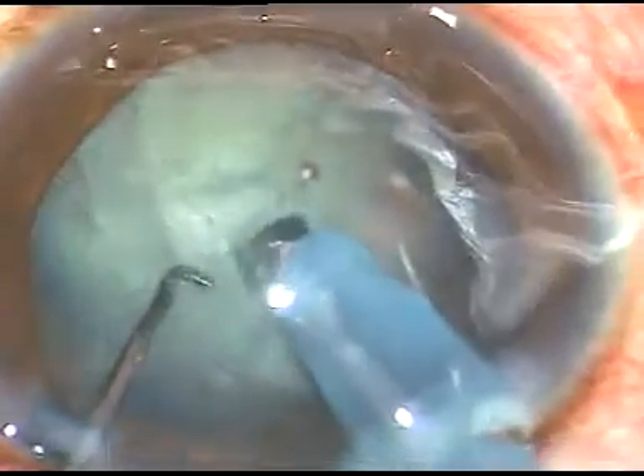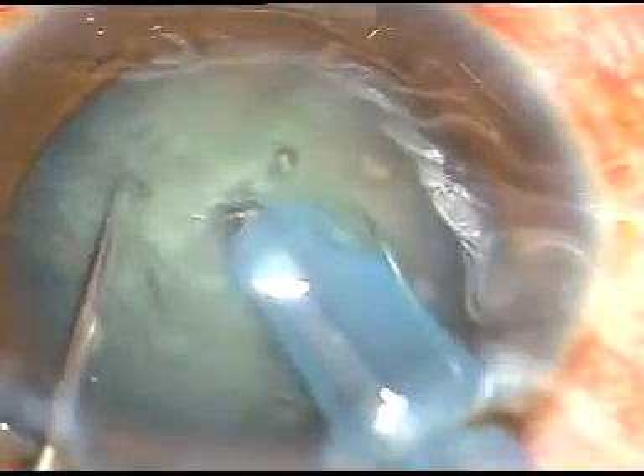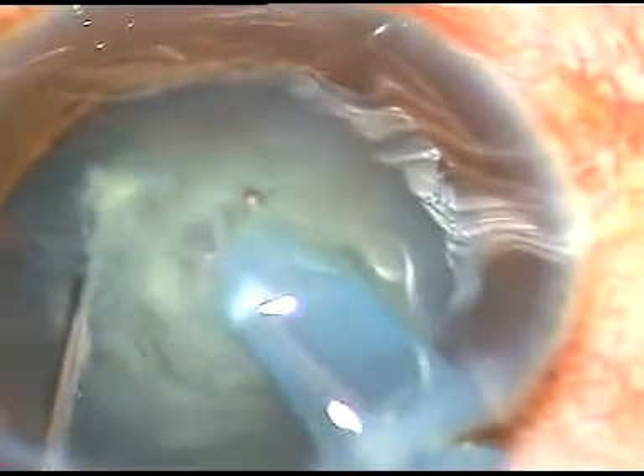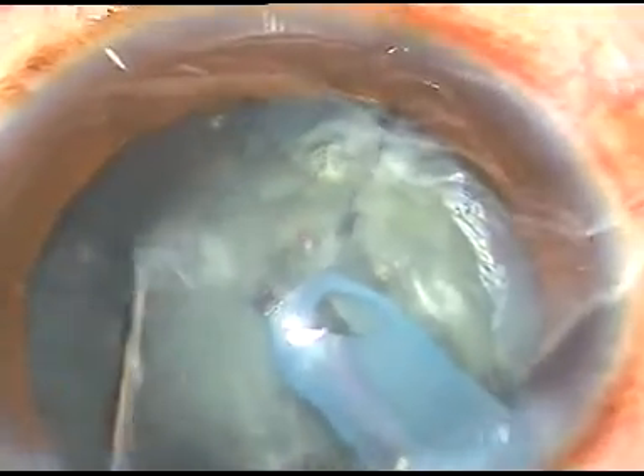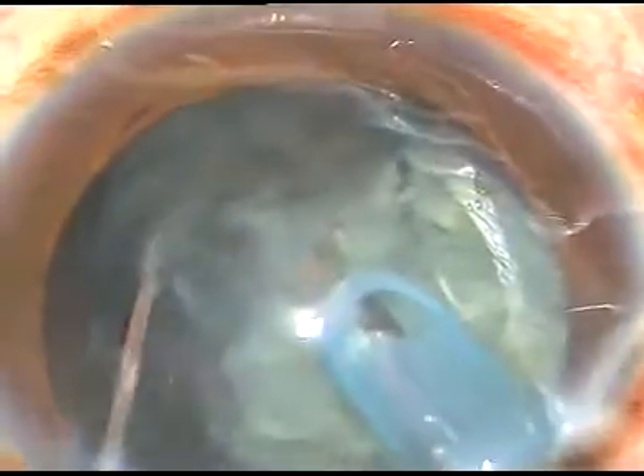After one or two sculpts I hold the nuclear mass with vacuum and I make this chop — this is the first chop. This is the second chop. Here I hold the nucleus and make another chop. Now I have already taken one nuclear fragment. The phaco power being used is 60%, flow rate is 45 ml per minute, and vacuum is 450 mmHg.